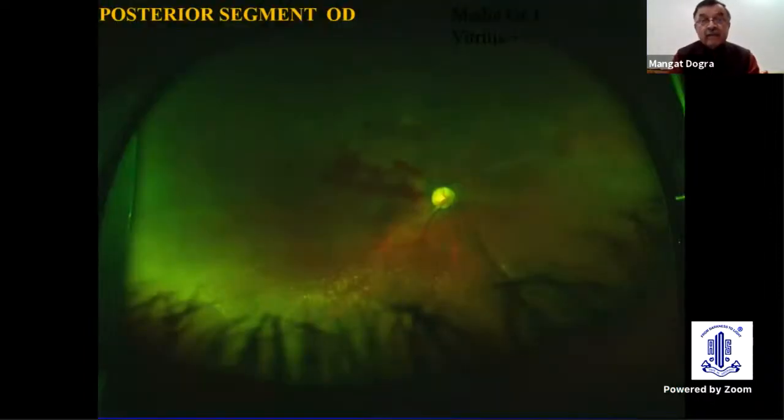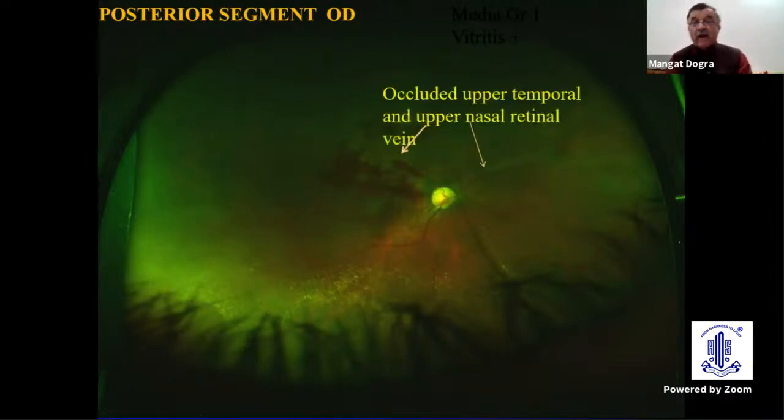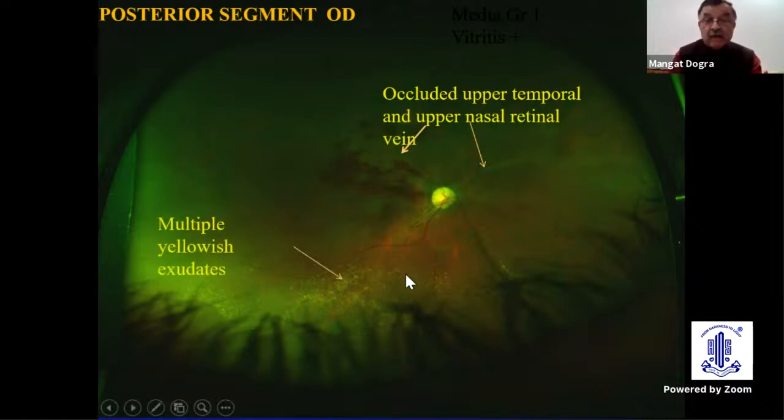I'll be showing you all that. This is the way the patient presented. You can see here that you have upper temporal and nasal occluded vessels. That is what the multiple branch vein occlusions are. And you can see other features here, multiple yellowish exudates inferiorly.